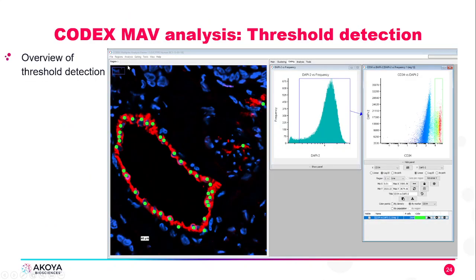This is an example of Codex MAV where we're thresholding. You can see a tissue that's been stained with CD34 in red, and I've detected where there are CD34 positive cells—that detection is apparent because of the green dots which are overlaying the cell nuclei.